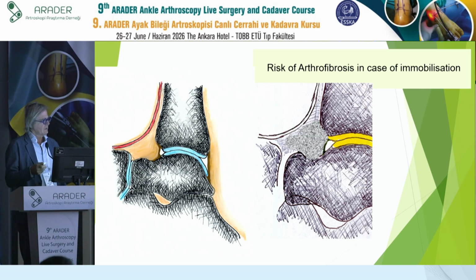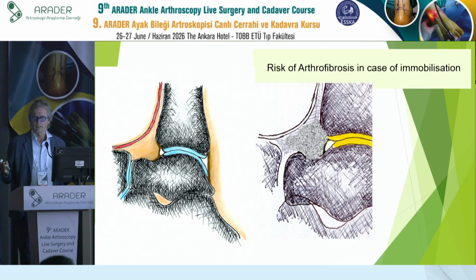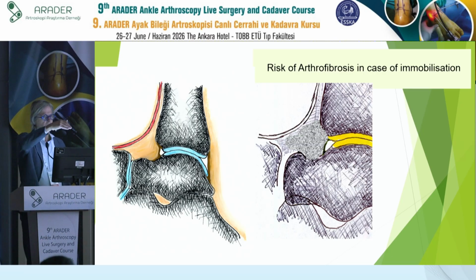You go in, you know where is the joint space, you go in dorsiflexion, you start shaving, you stop shaving, you plantar flex, and you hope that you see something move, but you don't. You dorsiflex again, go in with your shaver, go a little bit more proximal. You shave again, towards the bone, stop, plantar flex, you still see nothing move. Dorsiflex again, go a little bit more distal. And finally you see something move, then you're in the right direction, dorsiflex, and then finally you will see the joint, and then you open the curtain to the left and to the right.